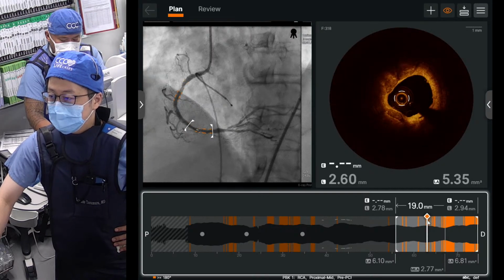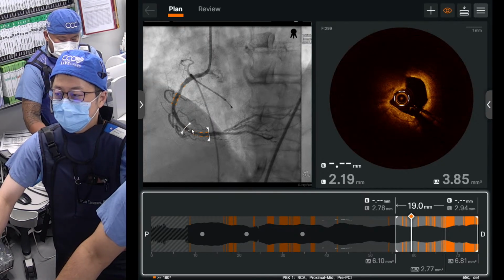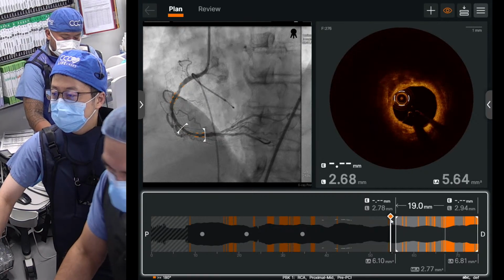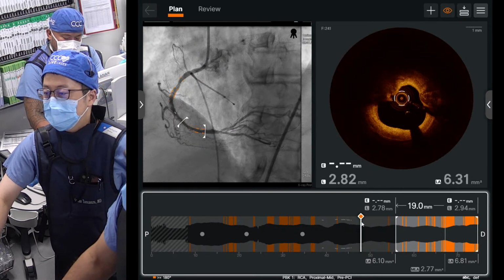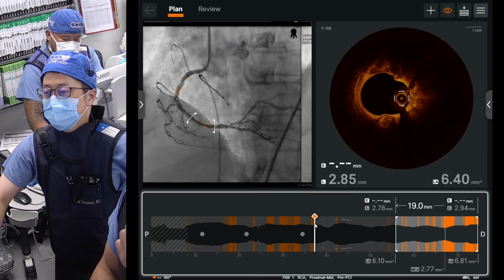Wow. Now come more proximally. Yeah, you see something is protruding. So this white dot has a small calcified nodule. Come more proximally. Can you see that a little? You have to show them the cursor on the angio that is moving.